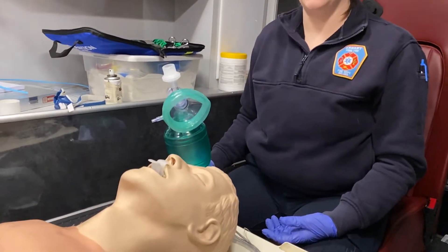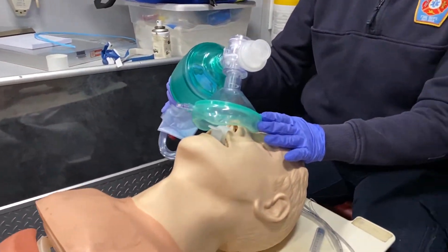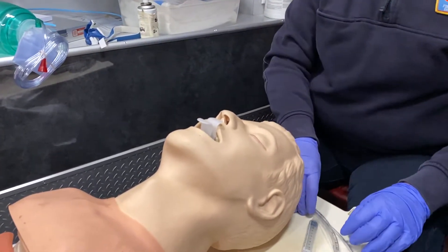We're going to go over oral tracheal intubation. I already have my patient set up as if we were bagging him, so we're going to imagine that my partner is bagging this patient. I want to make sure that all my equipment is ready.